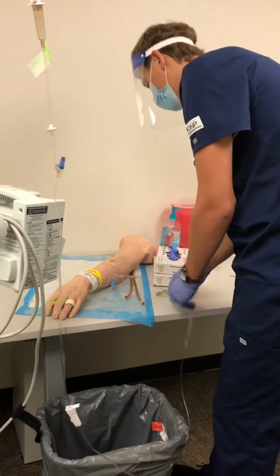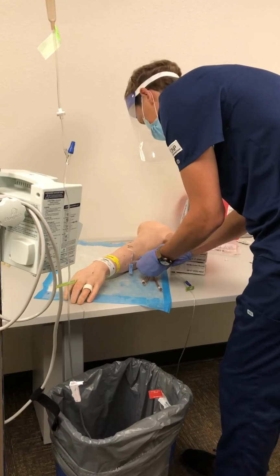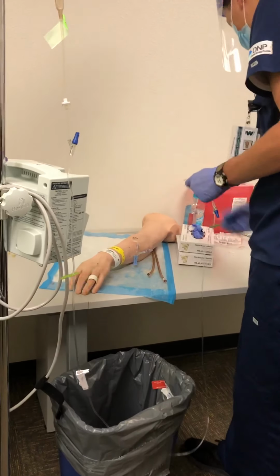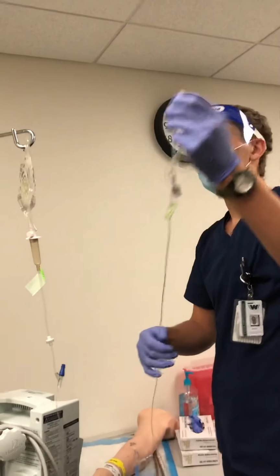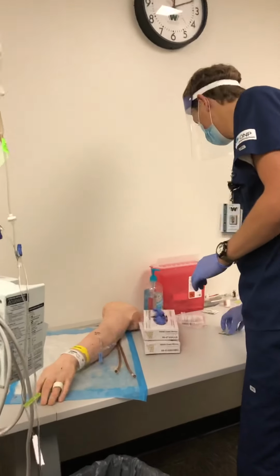Okay. And then I can also disconnect. Okay. Back on this to make sure that this stays sterile, because we may be able to use this tubing after if we need to install another one of these medications.